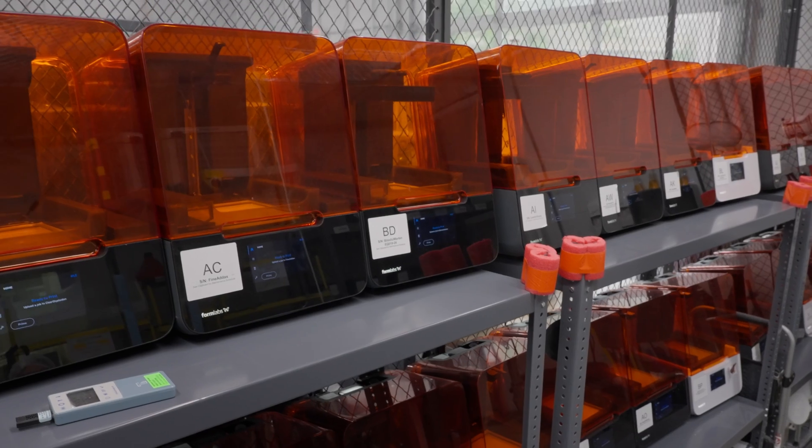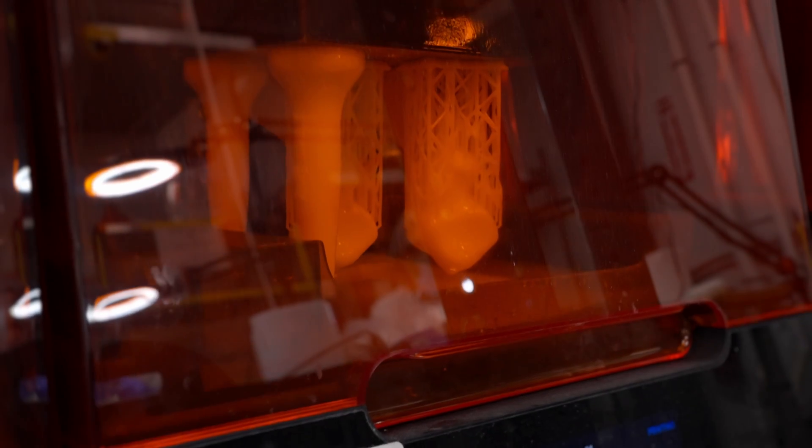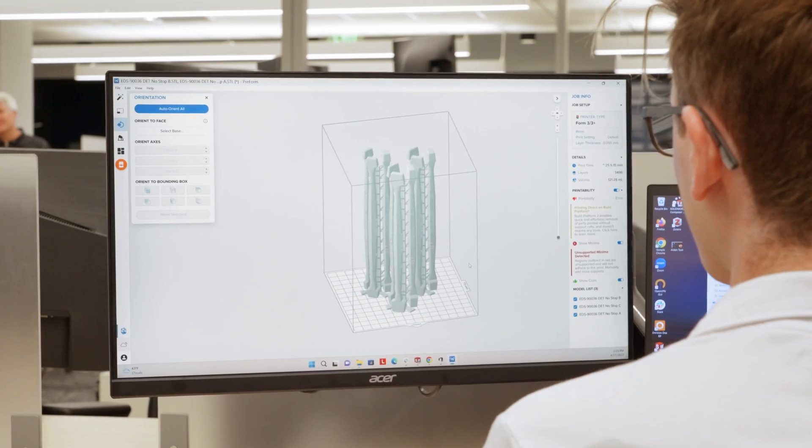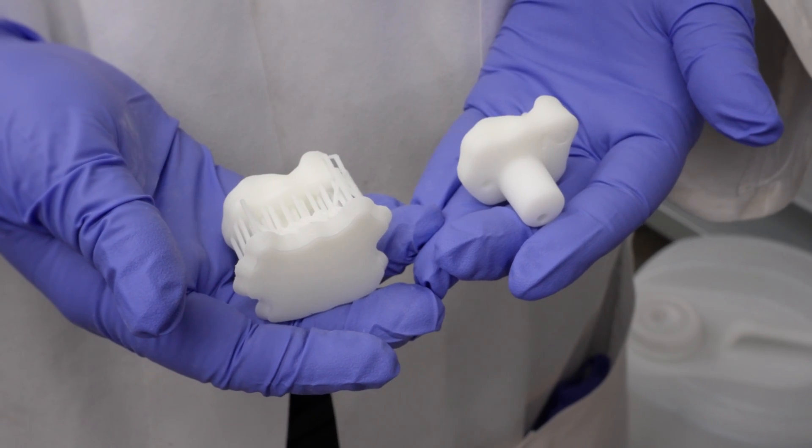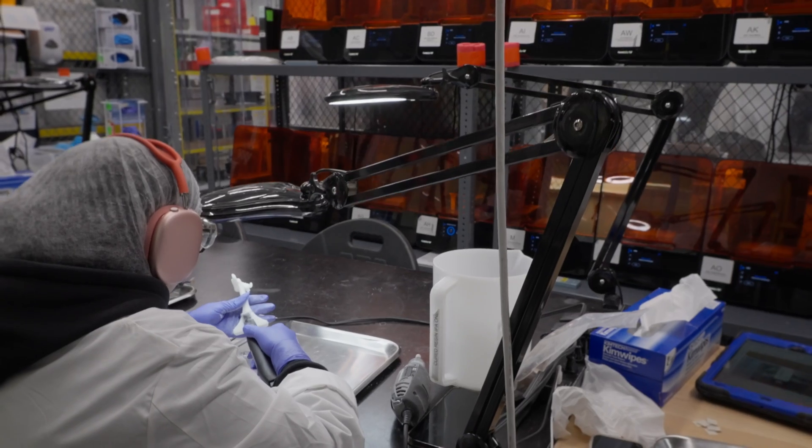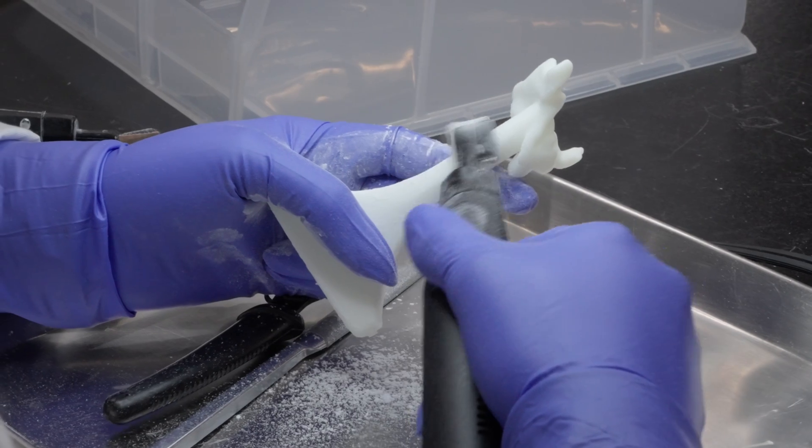The thing that we really like about using Formlabs printers is the flexibility that they provide us on the design end. We've worked with different printers and different applications, and often there are certain features that we find to be out of bounds due to specific print orientations, due to support material, particular cures that we have to use. When it comes to making any requests that a surgeon has, we're almost always able to provide that in a Formlabs material.